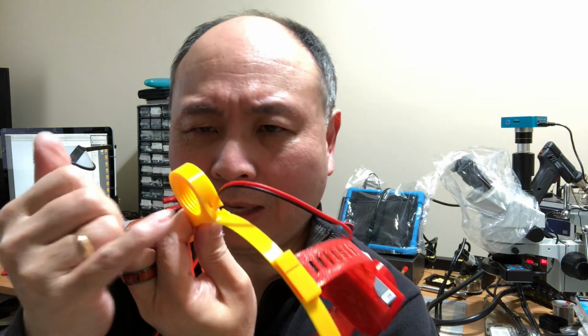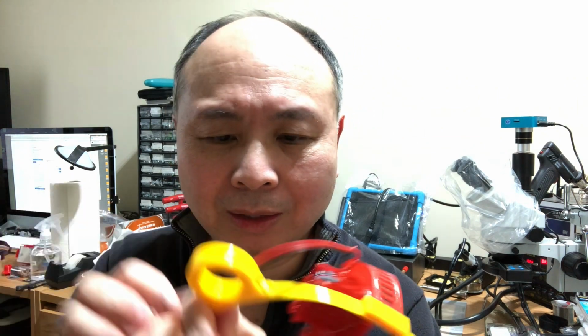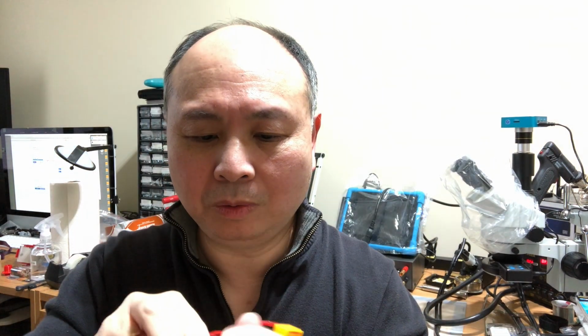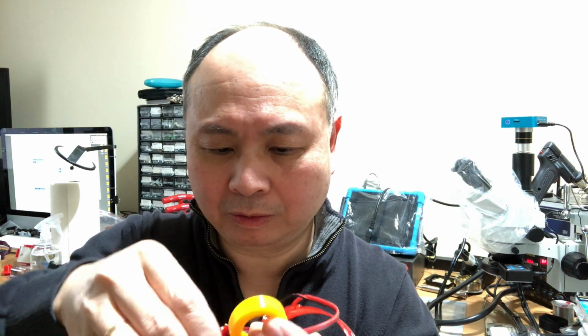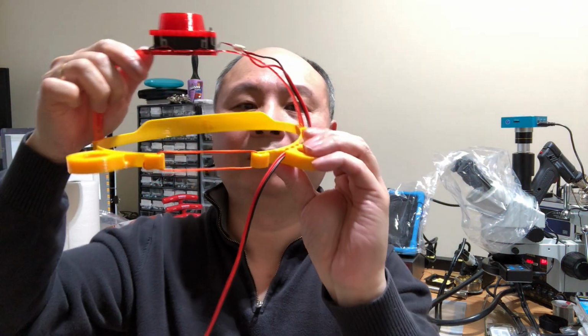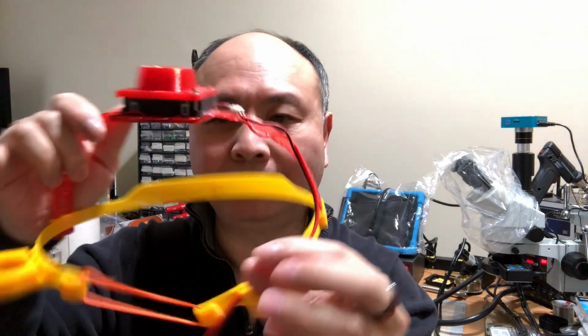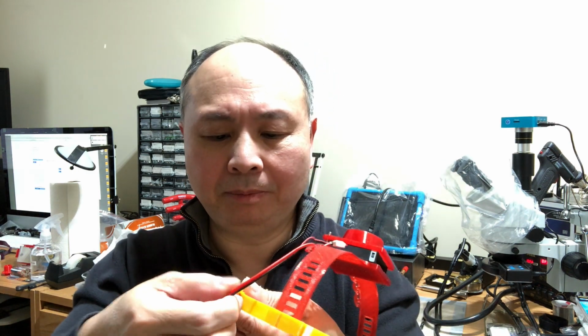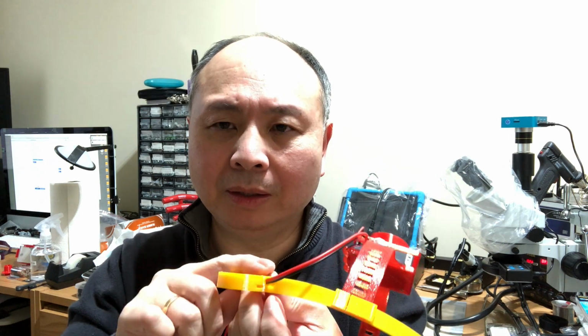You still have the hole to allow you to use a zip tie if you need, but now the Halo has this serpentine channel through which you can feed your wire to secure it. You might need to add something here to wedge it in place better if your wire is particularly thin, but this is certainly easier than the old zip tie. But you still have the zip tie option. Anyway, those are some updates for the Halo PAPR.